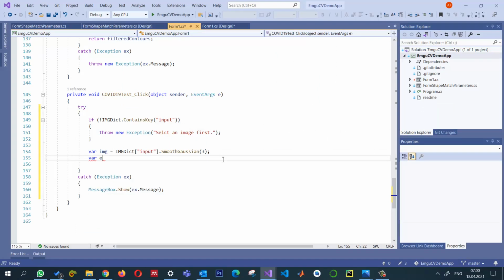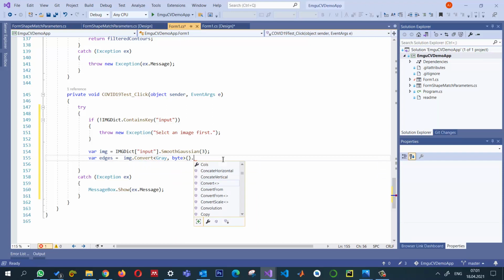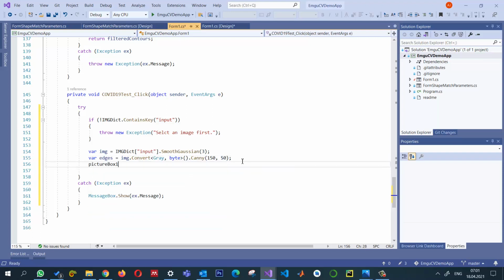I just create a new variable called edges is equal to img.Convert, and we are going to convert it into a grayscale image. The depth will be the same, and what I want to do is to apply this Canny edge detector to find the edges of these elements. So let me use a threshold. This is what we may need to come up with an optimal threshold value. Let me test with 150 for the strong edges, and the weak ones I just consider as 50.